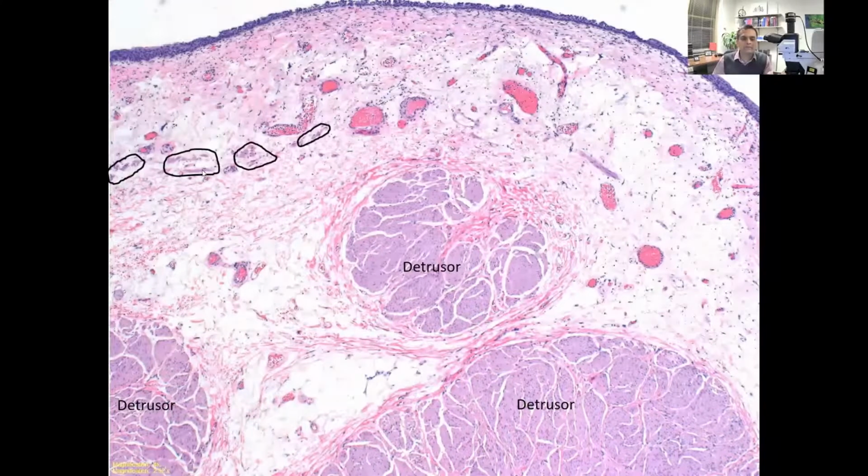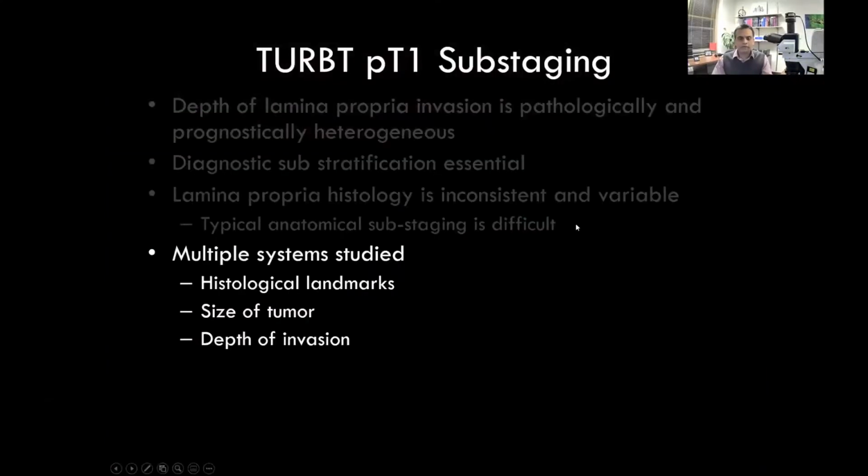These very flimsy bundles of smooth muscle that we find in the lamina propria. So you can see that these are not only flimsy, but disjointed. In fact, they are so disjointed that in some areas they're entirely absent, and then it continues elsewhere. So using this as a landmark in all biopsies also becomes very difficult because in some cases they may not be present at all, right?